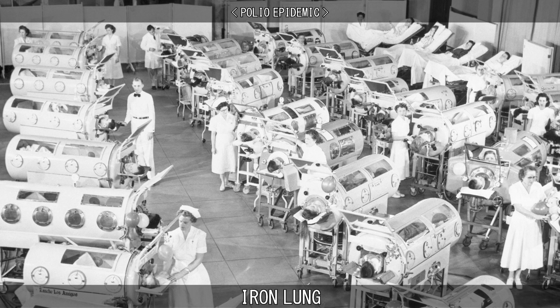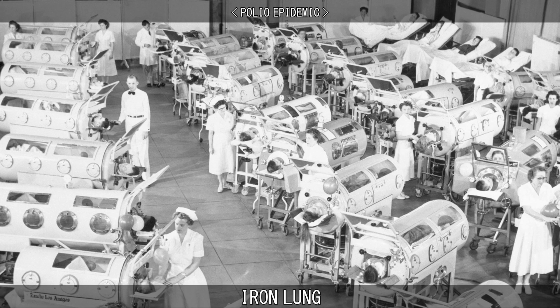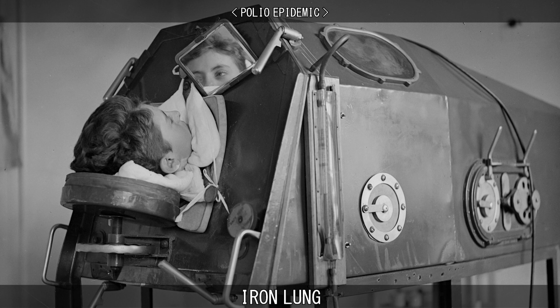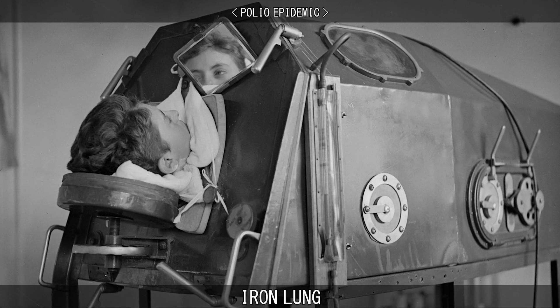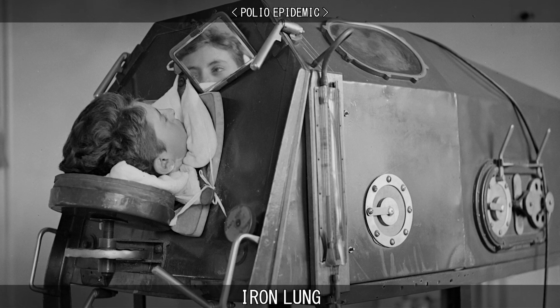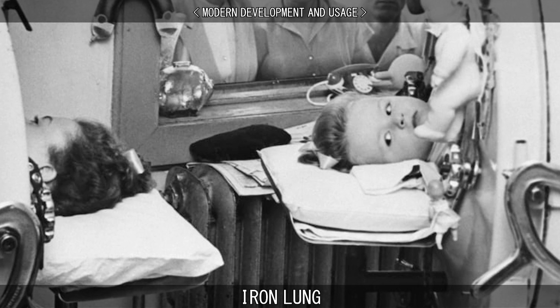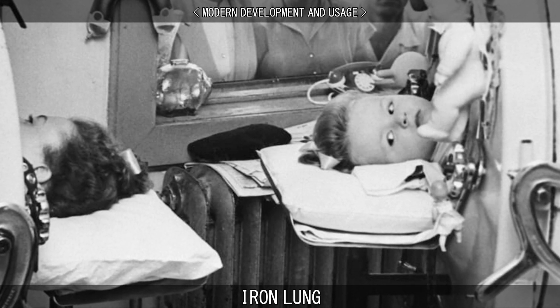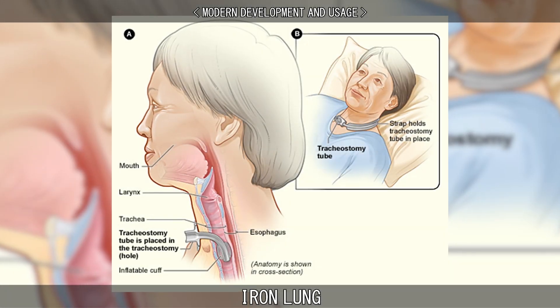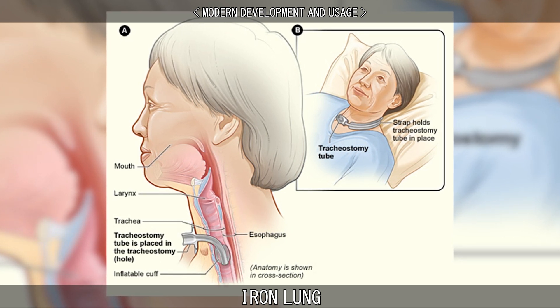Rows of iron lungs filled hospital wards at the height of the polio outbreak of the 1940s and 50s, helping children and some adults with bulbar polio and bulbospinal polio. A polio patient with a paralysed diaphragm would typically spend two weeks inside an iron lung while recovering. Polio vaccination programs have virtually eradicated new cases in the developed world. Because of this, the development of modern ventilators and widespread use of tracheal intubation and tracheotomies, the iron lung has mostly disappeared from modern medicine.